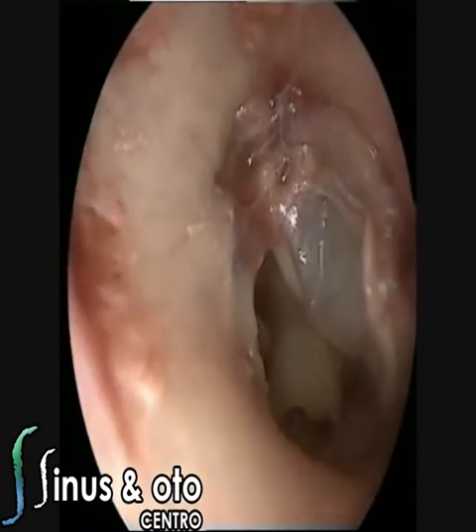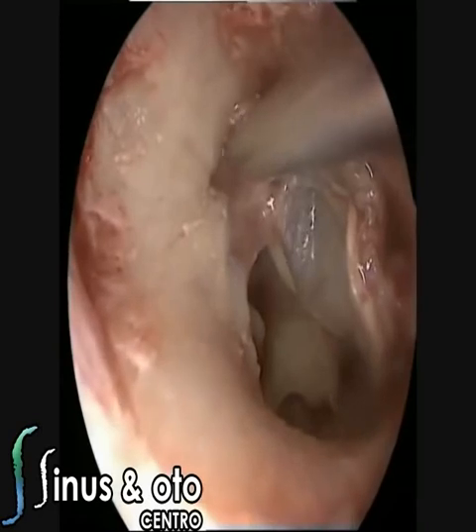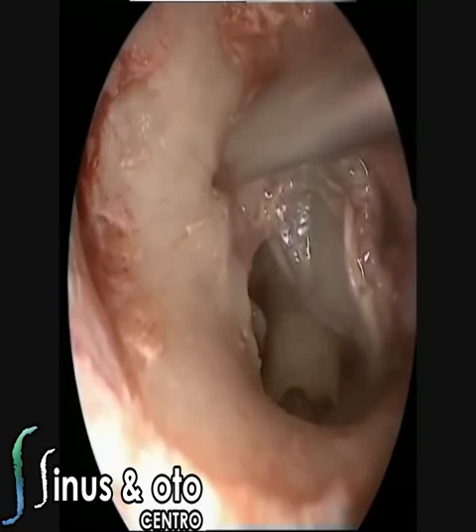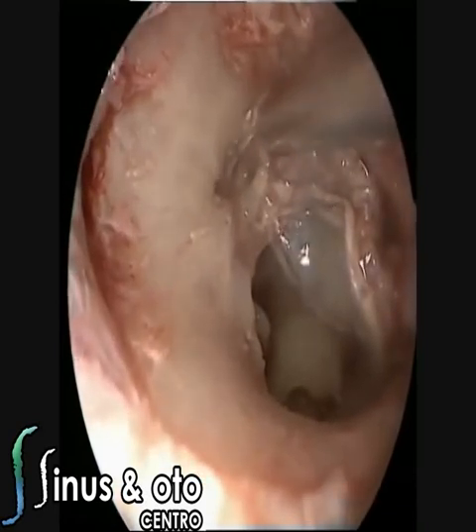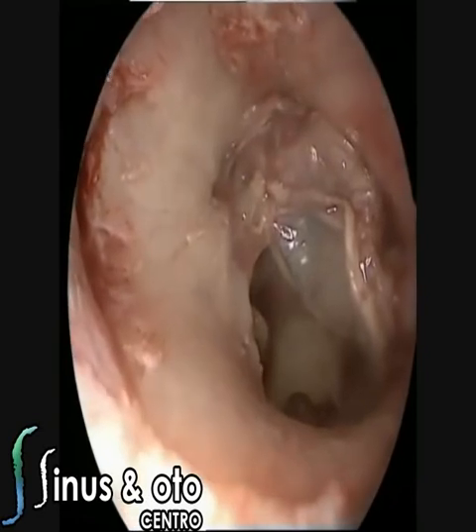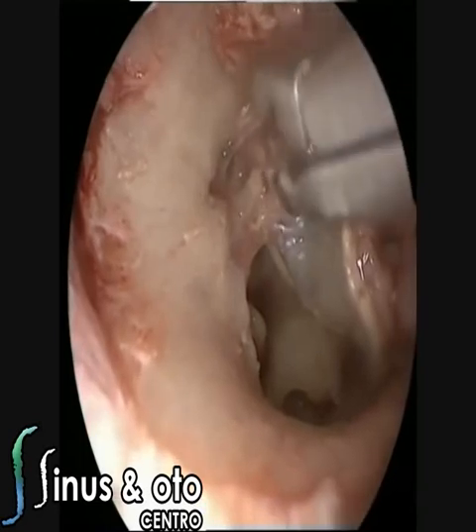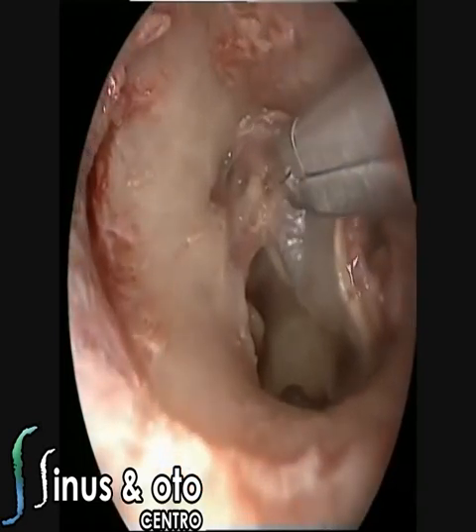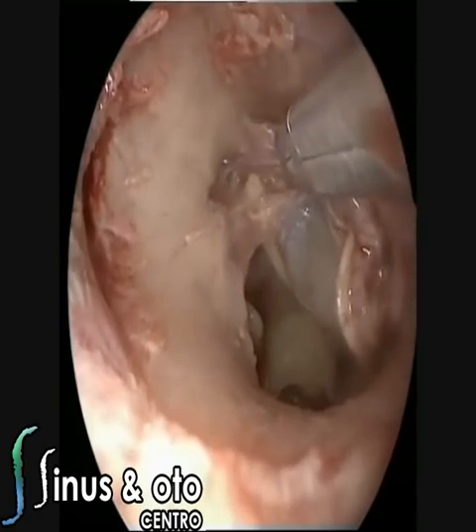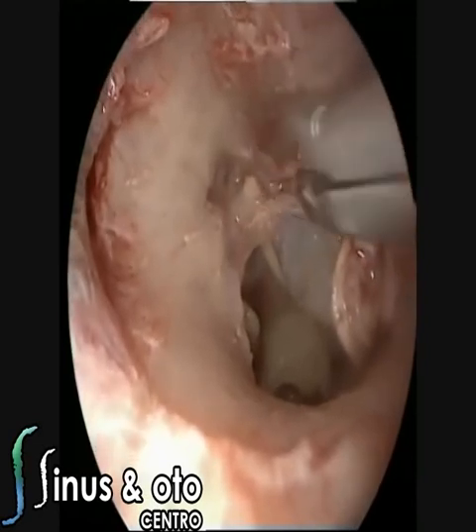The chorda tympani nerve is hidden in this specimen behind the scutum here. So when you open the posterior malleolar ligament, you can see the chorda tympani going right behind it in the direction of the middle ear. So we are elevating a little bit more the tympanic membrane from the malleus. Of course, this dissection is to demonstrate all the ligaments and all the structures that we can see with endoscopes at the middle ear.